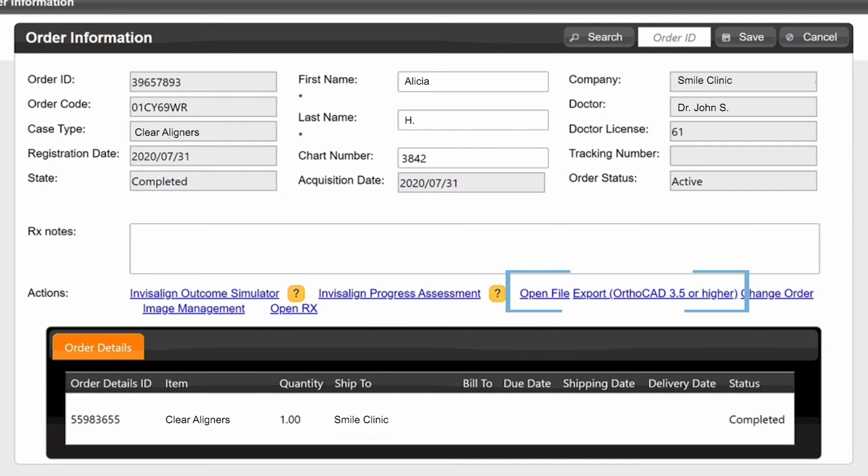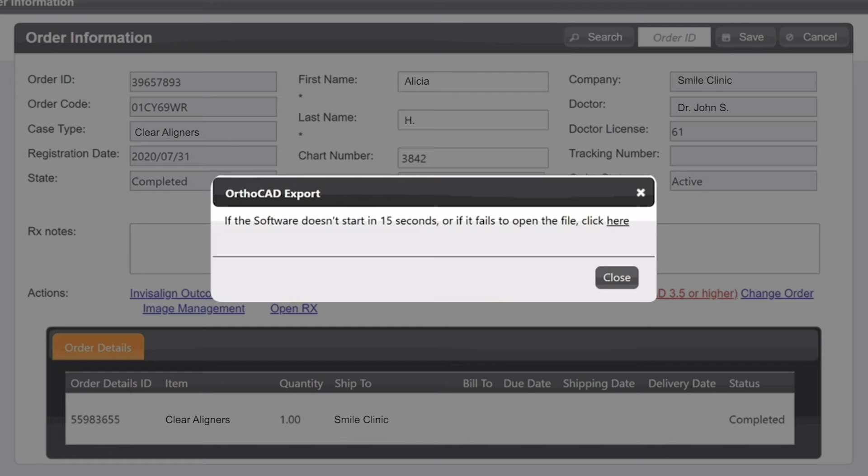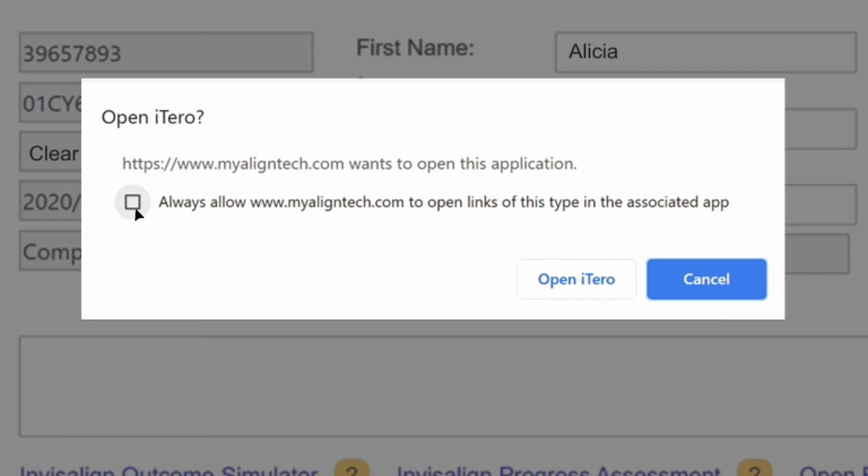Click Export OrthoCAD 3.5 or higher. The OrthoCAD Export pop-up window will open. Click OK on the prompts until a drop-down menu appears.